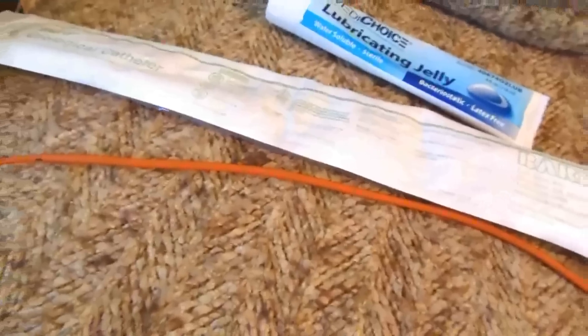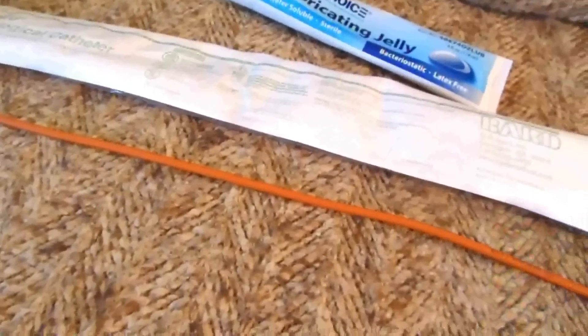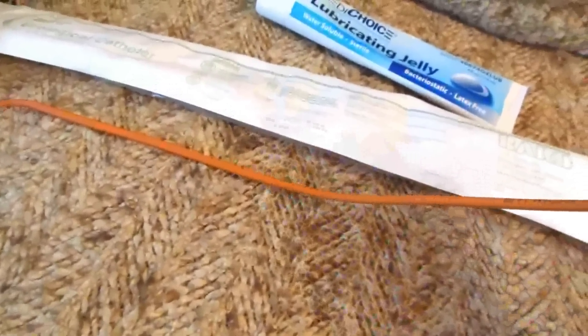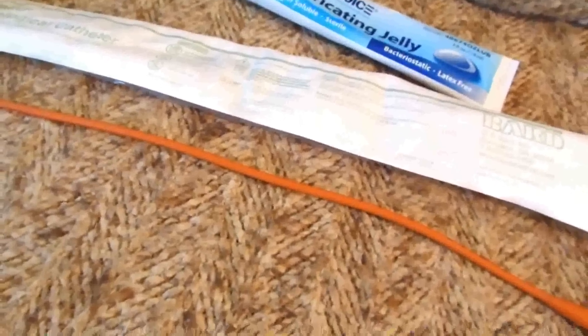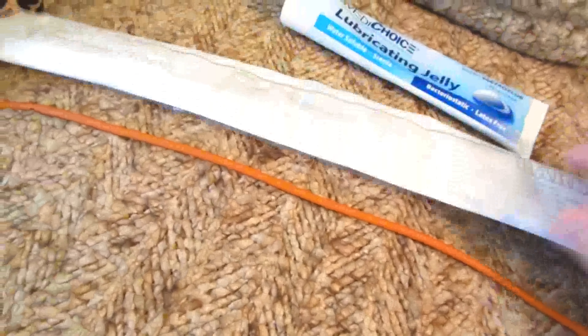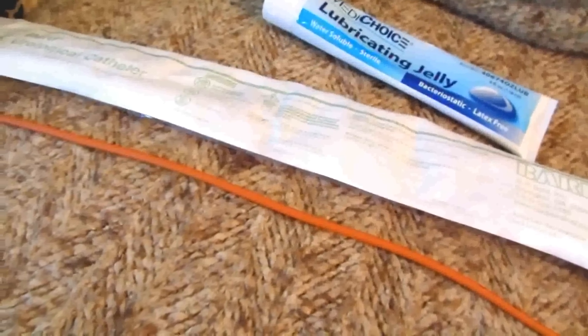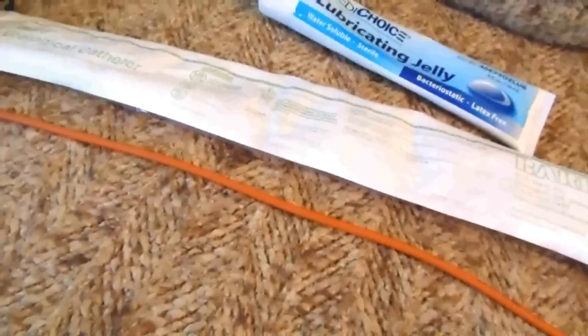These are not supposed to be reused — they're sterile single-use — but I washed this out and put it in a solution of colloidal silver at five parts per million in a jar with the lid closed. You take it out, dry it with a clean sterile cloth, and it's just as sterile as it came out of the package. If you have to reuse them, colloidal silver is great for sterilizing.